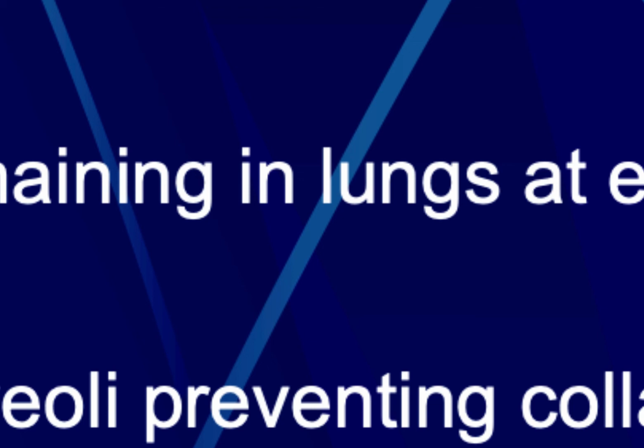If your patient's alert enough to hold the mask firmly against their face themselves, have them do it, and let them take a couple of breaths in. Coach them to breathe slowly, right, and explain to them what's going on in their body, as best as they can. And really the best way to explain it is that they're taking one of the better breaths that they have probably taken in days.